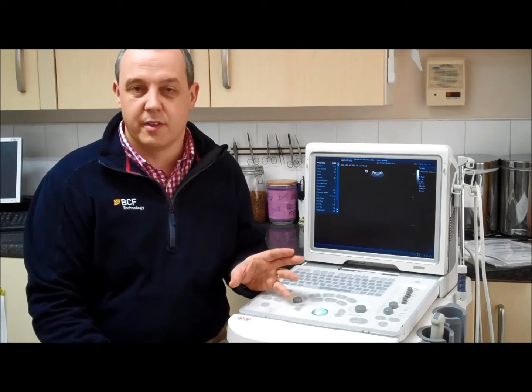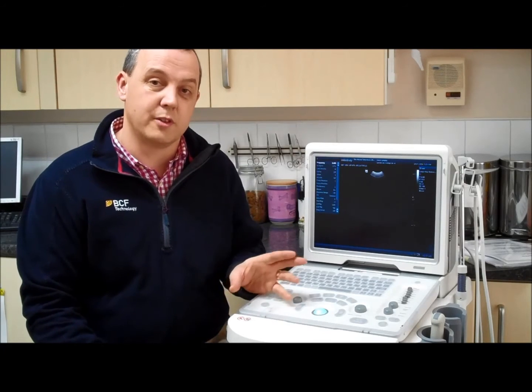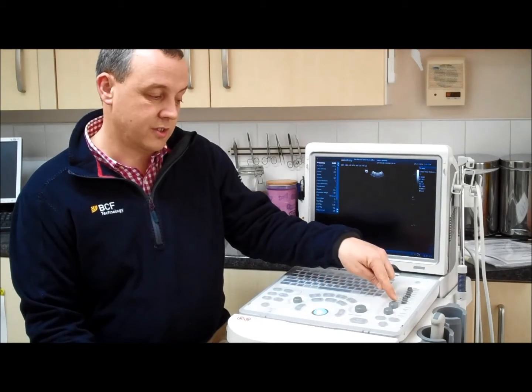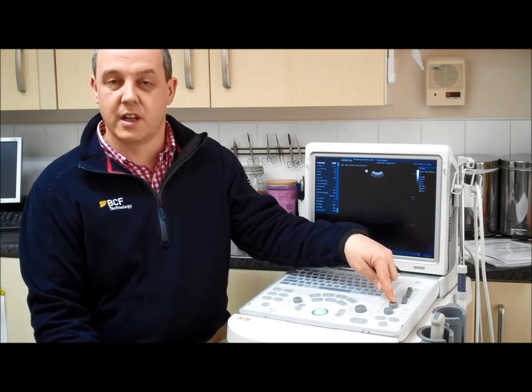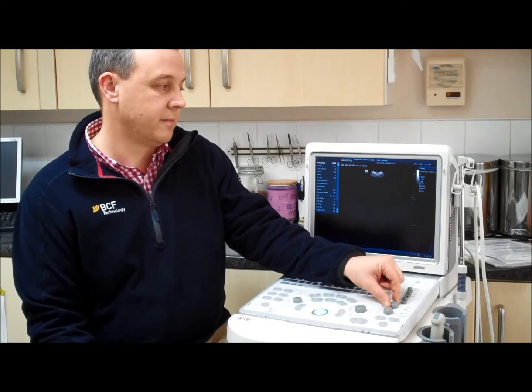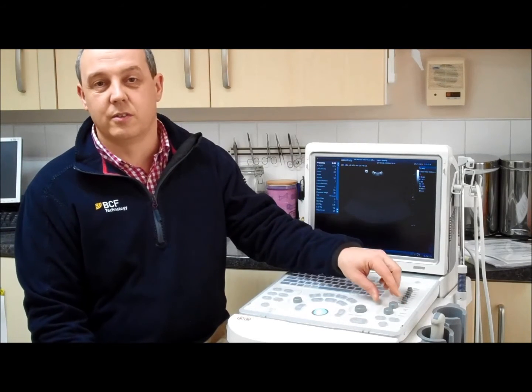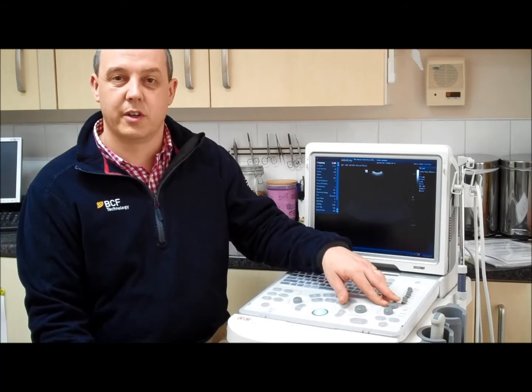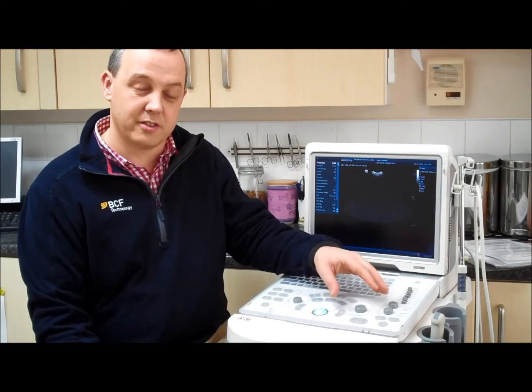If the image is too dark, it may well be a contact problem — you might not have enough gel on the animal or the area may not be clipped. If your animal is prepared well and you're still not getting a bright image, it may be that you need to change the frequency, which is located on the focus button. Simply press the focus button and the frequency button lights up, allowing you to adjust the frequency shown at the top of the screen. The machine runs from 5 to 8.5 MHz, enabling you to scan a larger range of dogs and cats with one probe. Lowering the frequency will give you a brighter image but less resolution; increasing the frequency will give you greater resolution but less penetration.